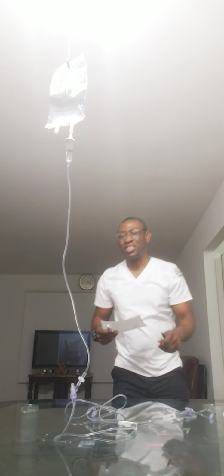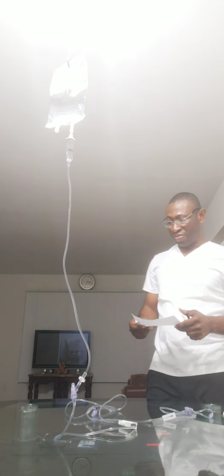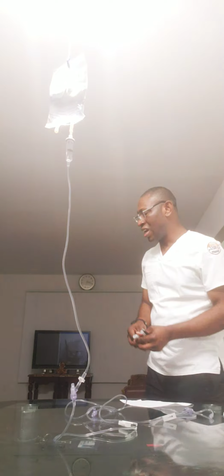Knock, knock, knock. Hi, Mr. James. My name is John Paul. I'm going to be your nurse today, okay? And I'm here to give you your IV push medication. Could you help me please confirm your name and date of birth? Okay, can I see your armband?